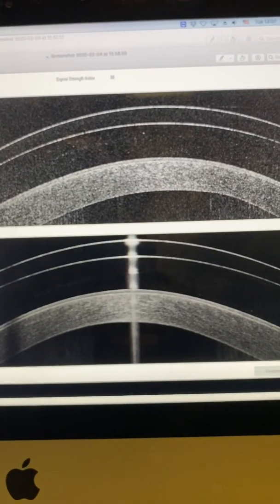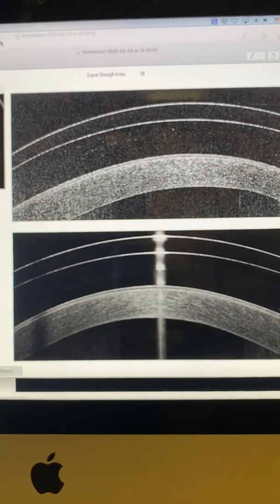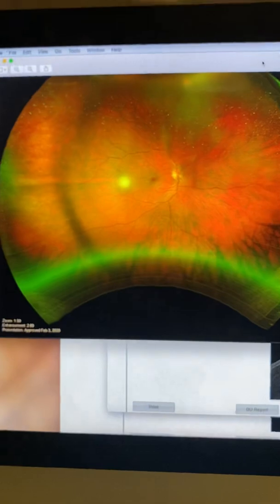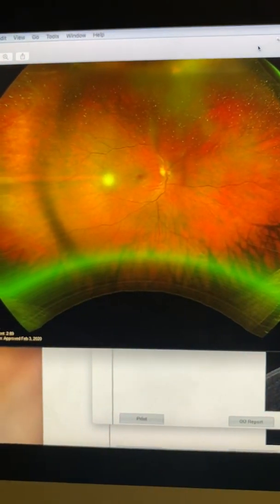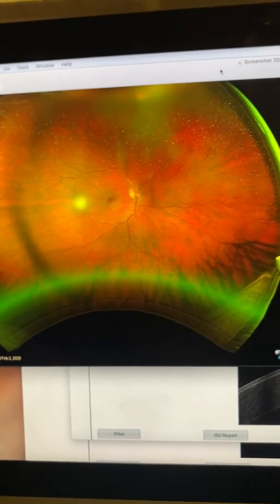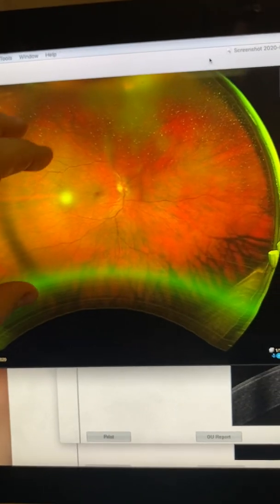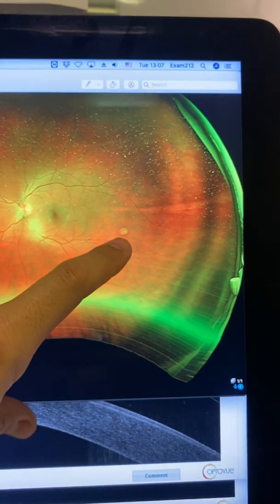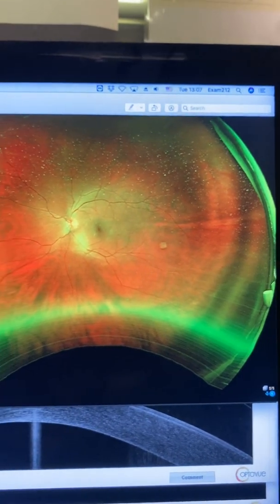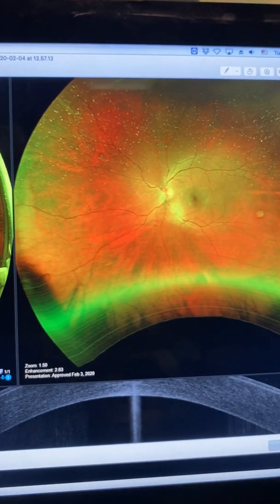less action going on here, although we feel that the lens is sitting too far away from the cornea. We'll look at the Optos broad view fundoscopy that's relatively normal. We can see just the shadowing of the correction part of the PROSE lens in the Optos wide field retina exam, an atrophic retina area here that's scarred. Nothing significant. And we'll go back to the first pictures that we saw.